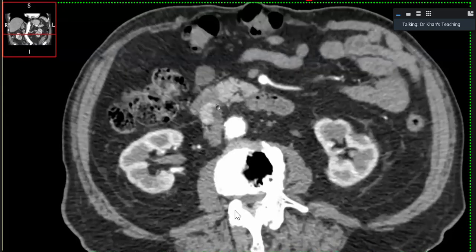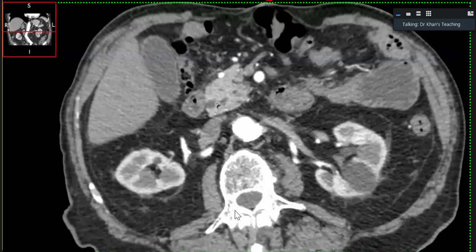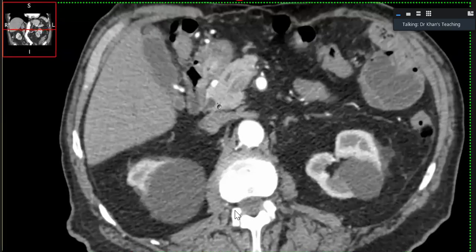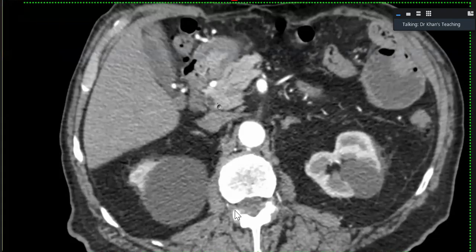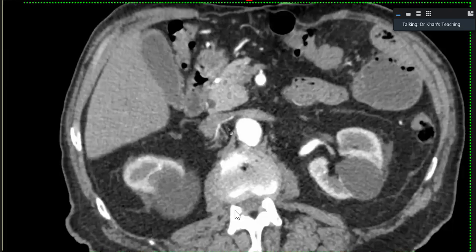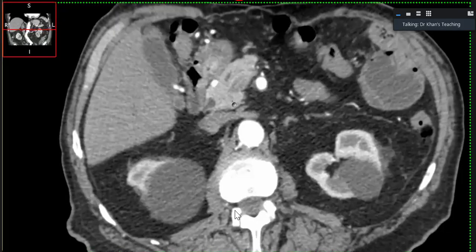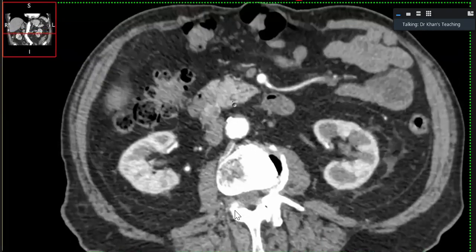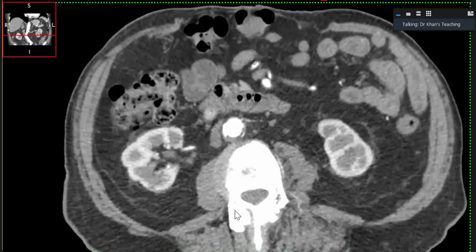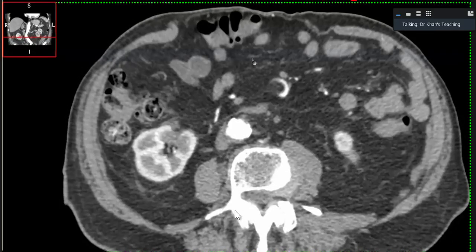It is sitting outside. But this area is the classical gastrinoma triangle. And I've shown you this picture quite a few times from Radiographics. You can Google it, Radiographics, a good picture, which tells you that all of this area, including the area where our tumor is, is known as the gastrinoma triangle. So this word was not coming to your mind. Now, as soon as you have picked up a gastrinoma, you should do three things.